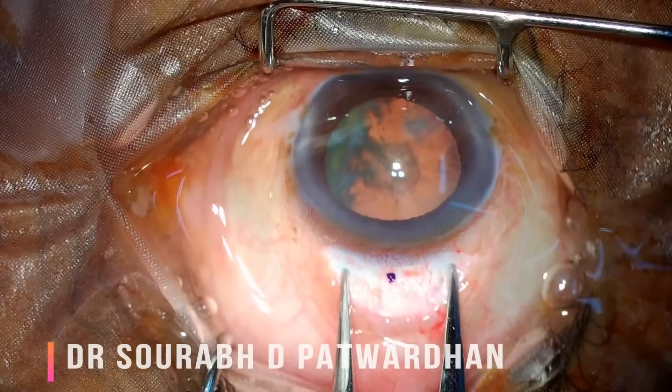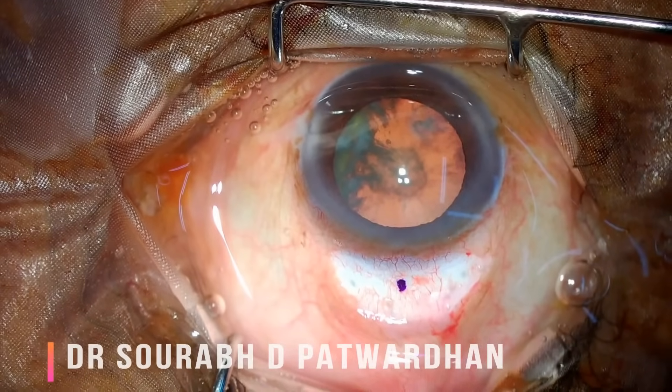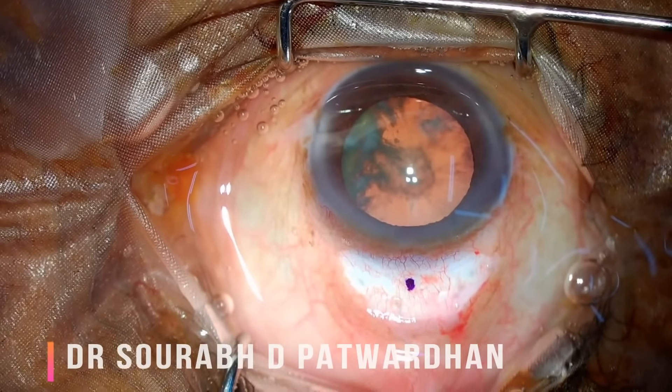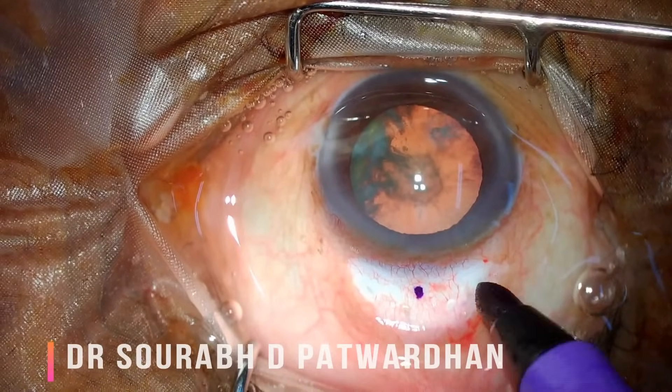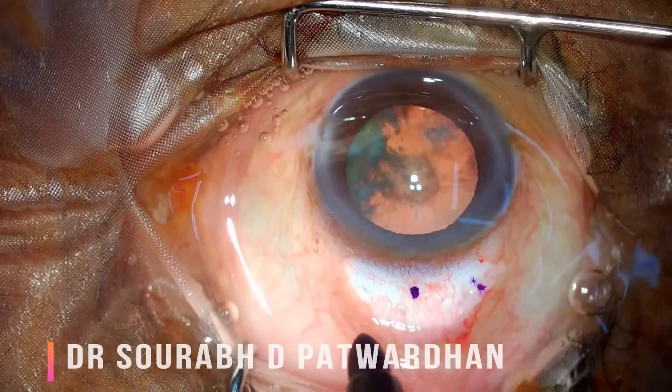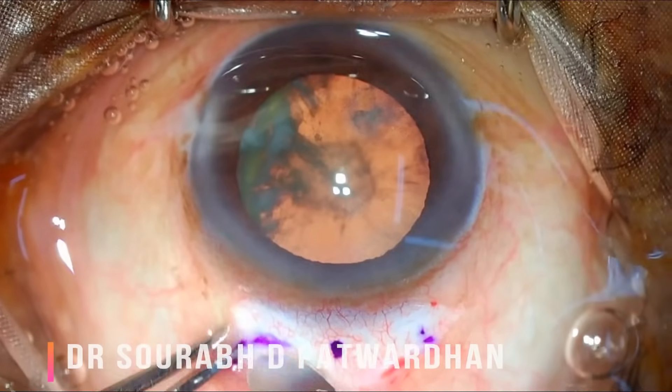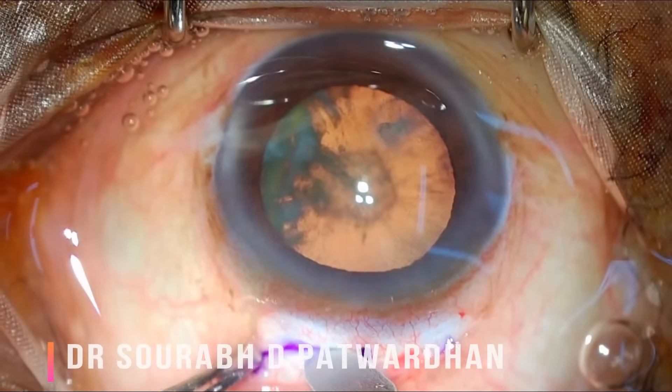I am marking 6 millimeters here. I am using gentian violet paint just to demonstrate how I mark the scleral incision. You can also use certain markers — there is a SICS marker available — or you can simply measure like this.